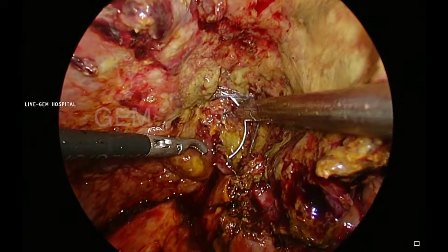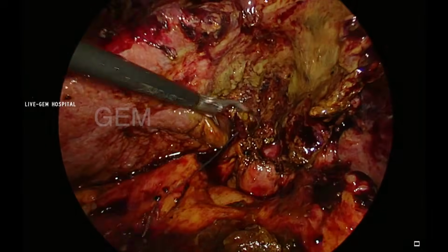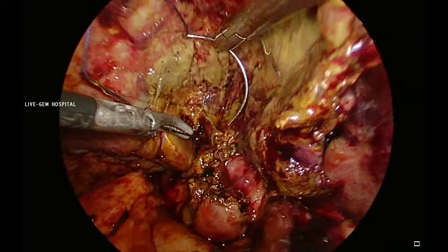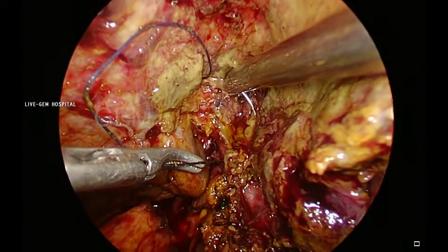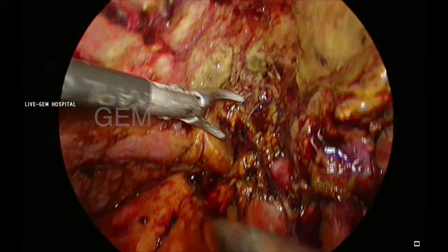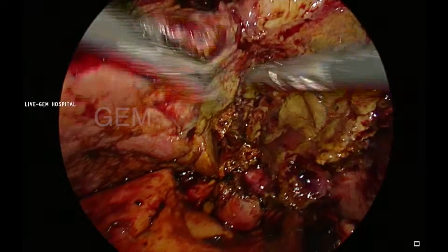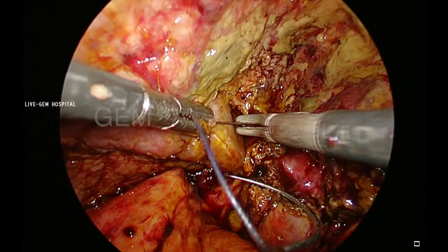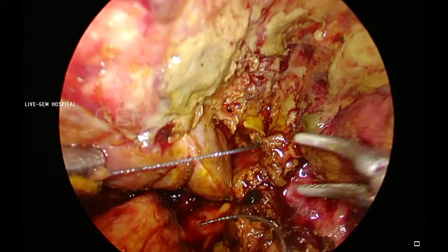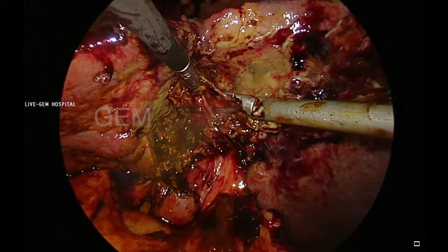So I include the posterior wall of the gallbladder along with this, because otherwise it is very friable. The suture cuts through the wall when I am tightening it. So I am suturing in a very slow and gentle way. I put an Aberdeen knot and then tighten the knot, because there is very little suture. So the infundibulum suture has been done.